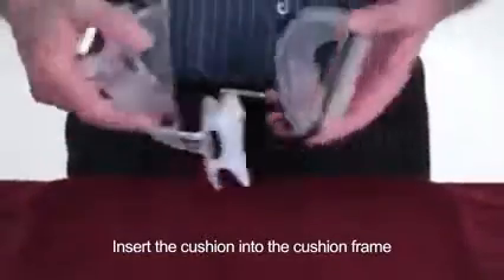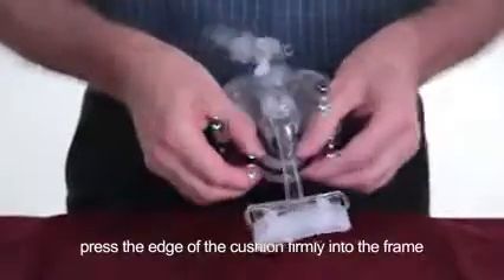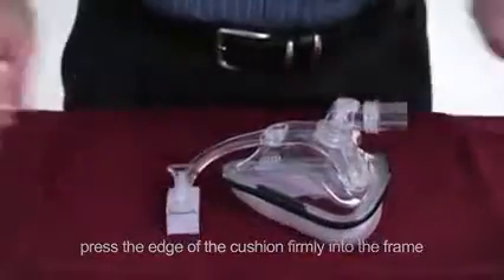Insert the cushion into the cushion frame and press the edge of the cushion firmly into the frame.